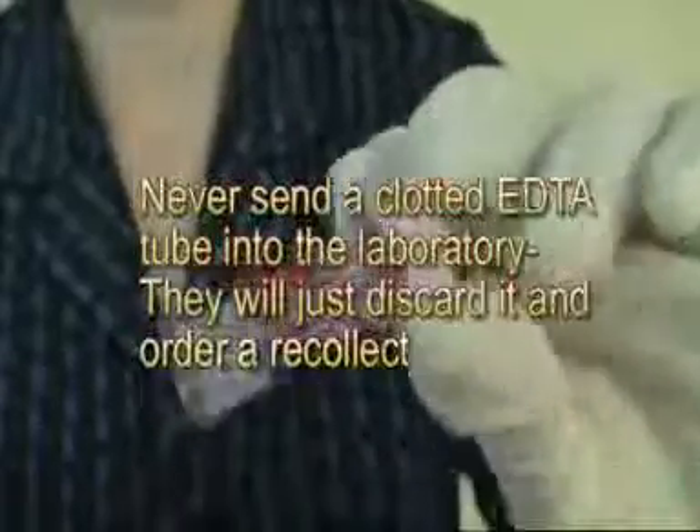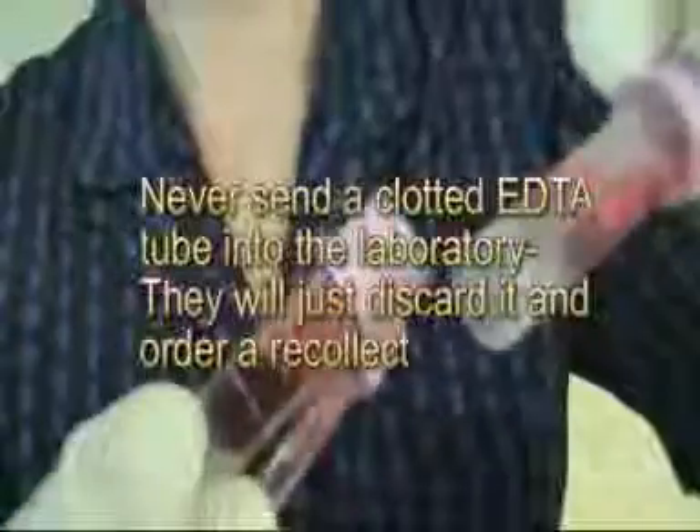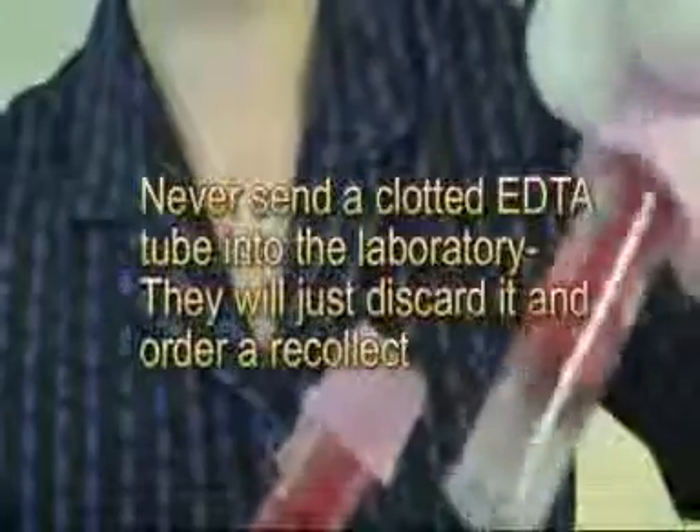This is what a clot may look like in an EDTA tube — the blood will not flow. When you invert the tube, the blood should be free-flowing. If the blood is not free-flowing and you see some lumps, you know that the sample has clotted.